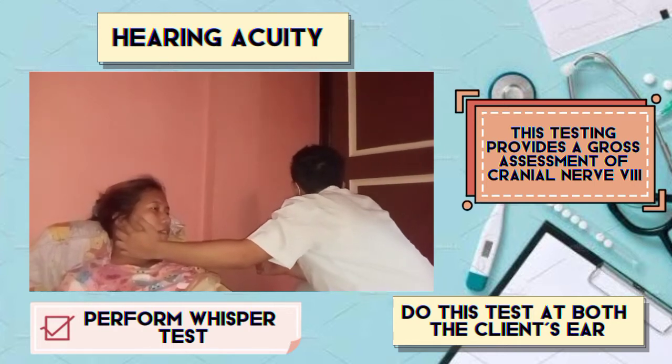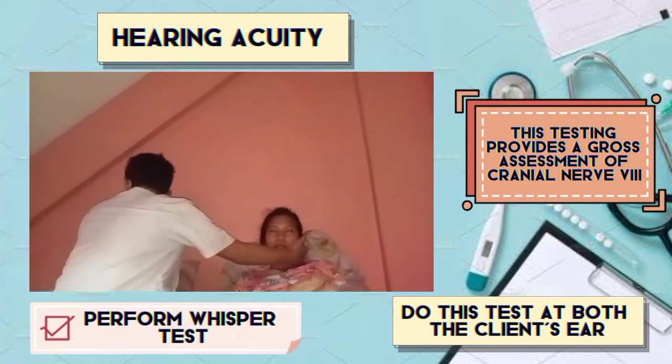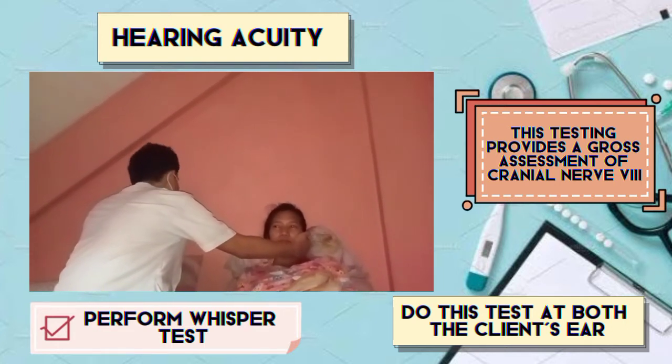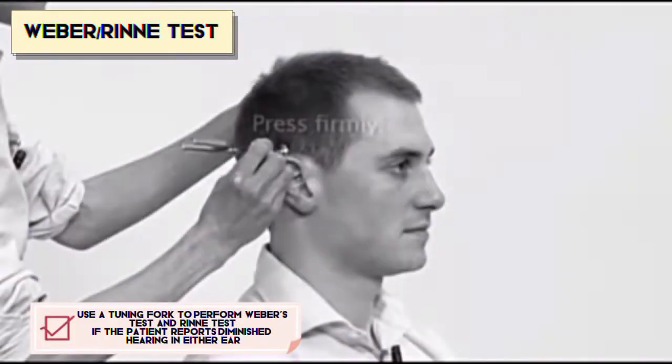Banana, apple, orange, watermelon. Alright now. Next, perform Weber and Rinne test. Use a tuning fork to perform Weber's test and Rinne test if the patient reports diminished hearing in either ear.